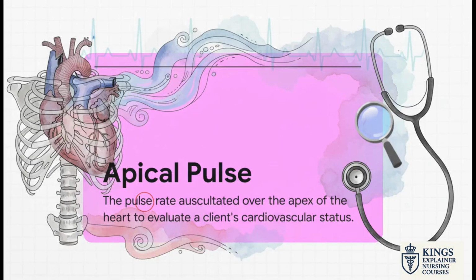So, what is the apical pulse really? Well, it's exactly what it sounds like. We're listening directly over the apex of the heart. The key word here is direct. This isn't just about counting beats. It's about getting the most accurate, unfiltered information about how your patient's heart is doing. It's like hearing the truest voice of the heart.